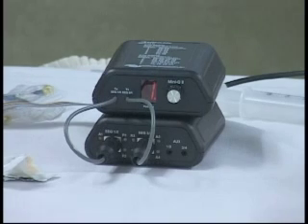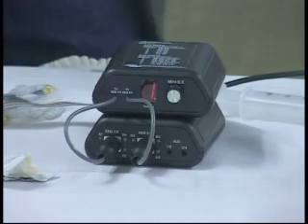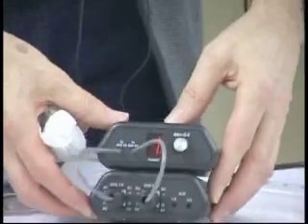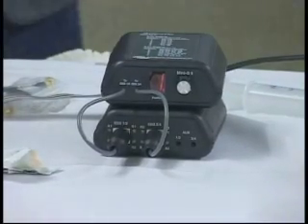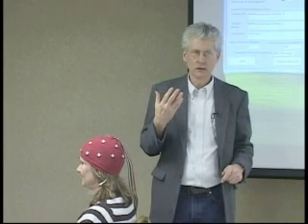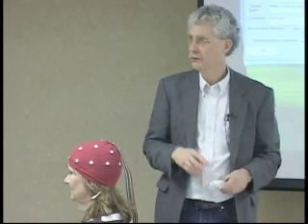Now we won't know just how good the connections are until we look at the little lights in the front. I can't see the front — you guys can see the front. Hey, they're green! We're good to go. Now some people — easy as pie. Other people, they'll be going like this, poking and looking at that light and it's still not green. Did you use conditioner? Did you use hairspray? Some people's skin seems to be more resistant to this process than other people's skin, and we noticed that even with paste in the old days. Sometimes it takes a little more patience, but you get lucky, you get a good day, and it just all goes smooth — you've got those green lights. So now we're going to let Tom take over from here.